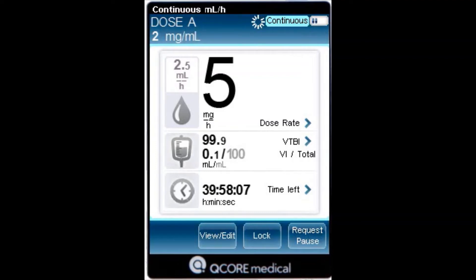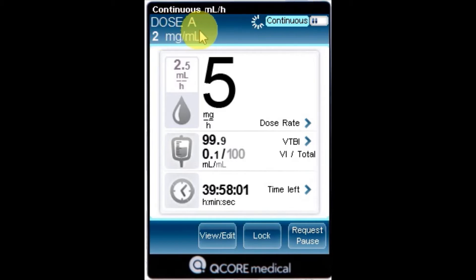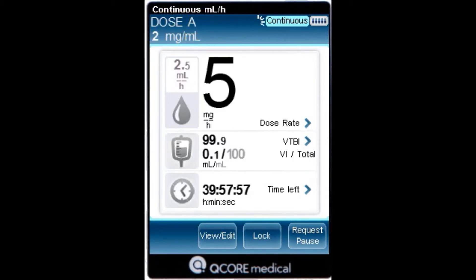Throughout the infusion, the following information is displayed on the screen. Drug name: the name of the selected drug is displayed on the indicators bar when working with the drug library.